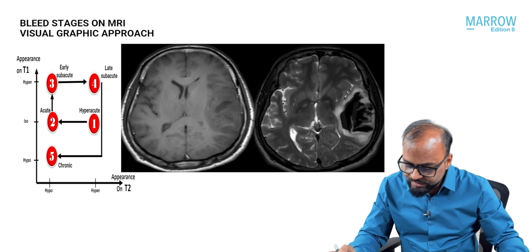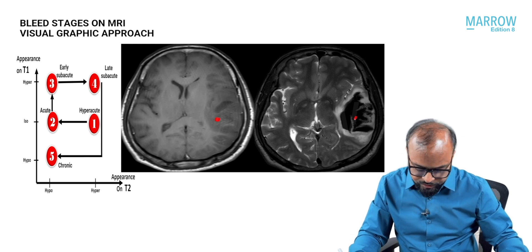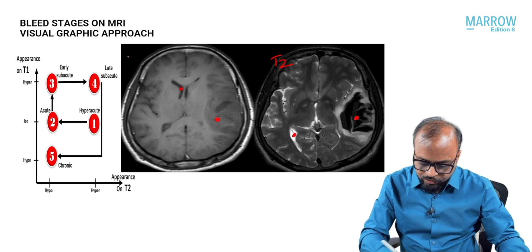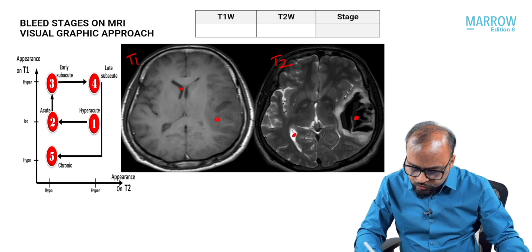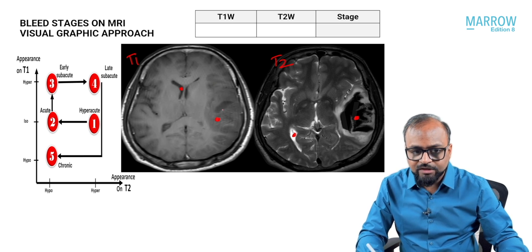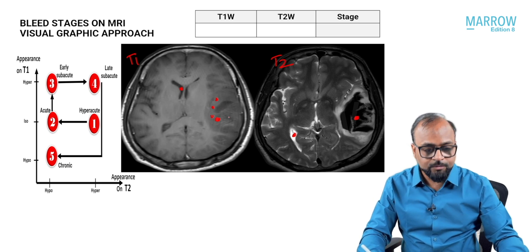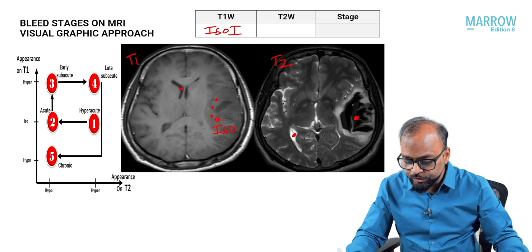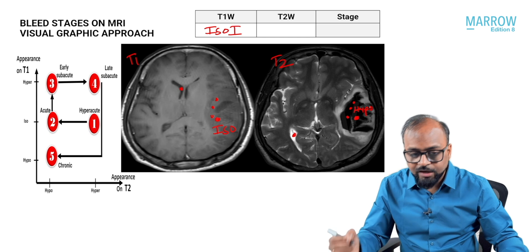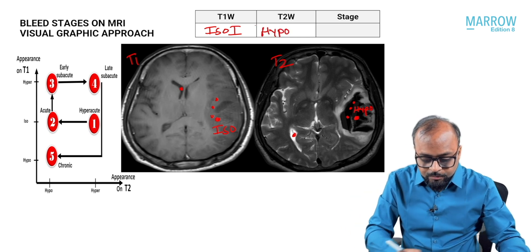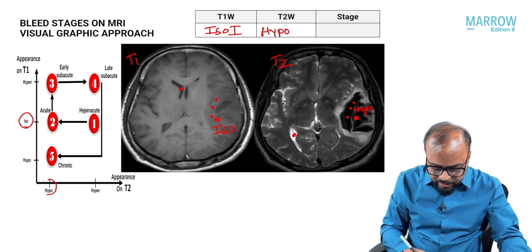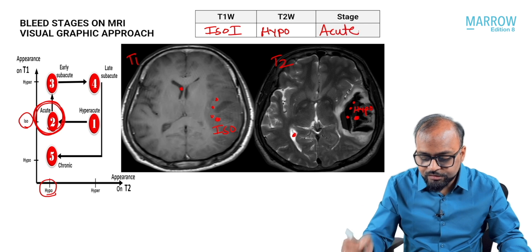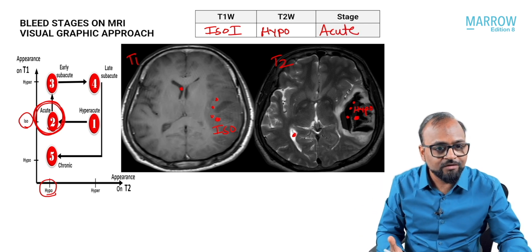Now looking at the next image: the lesion is identified here. Water is bright on T2 and dark on T1. Most of the lesion — except a small central part — appears similar to brain on T1, so it is iso-intense. On T2, most of the lesion appears dark, so it is hypo-intense. On the graph: iso on T1 and hypo on T2 places us at the acute stage of bleed.